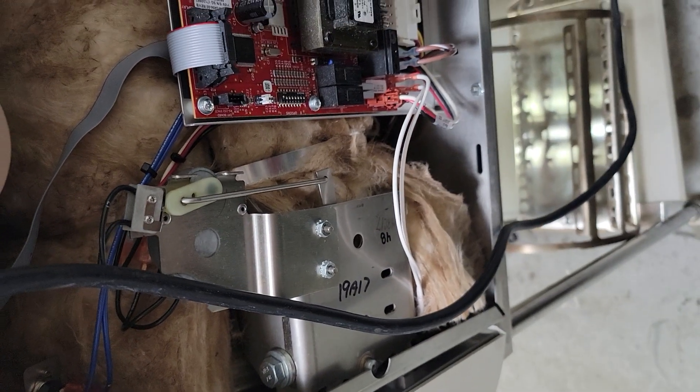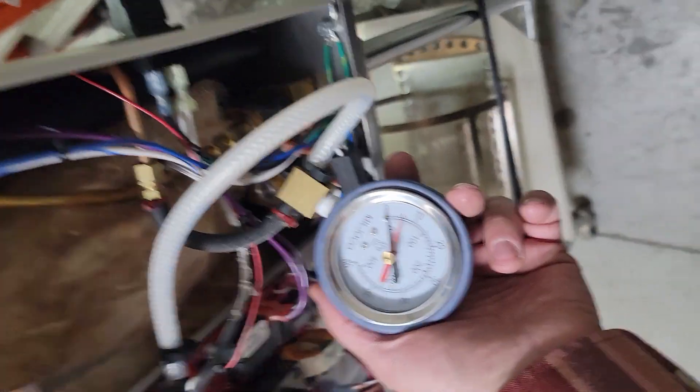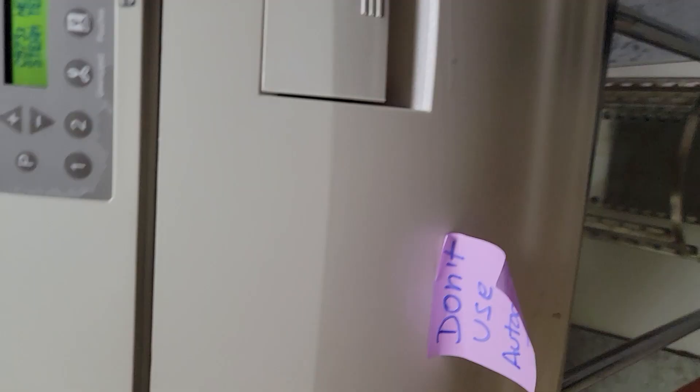I showed you the over-temp limit switches down there — I guess we should have tested those out too. Could be a bad temp sensor, could be a bad over-limit switch. Let's dig in.